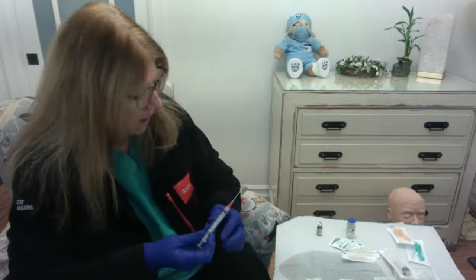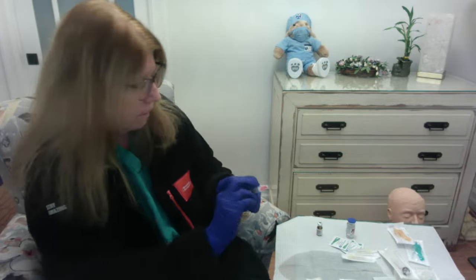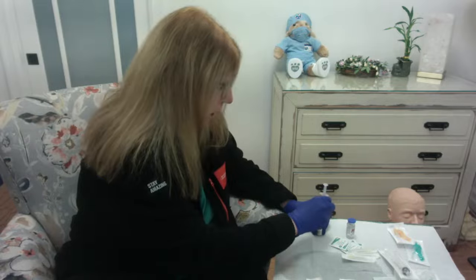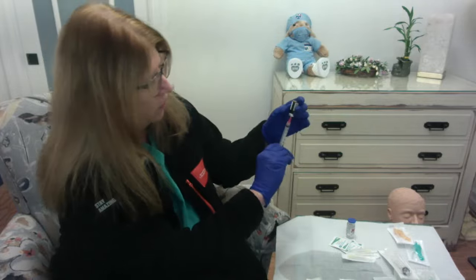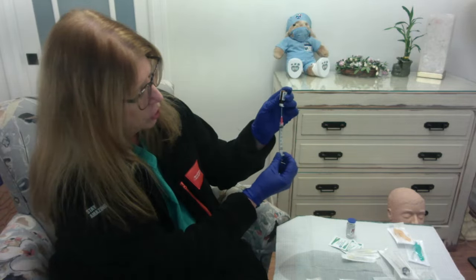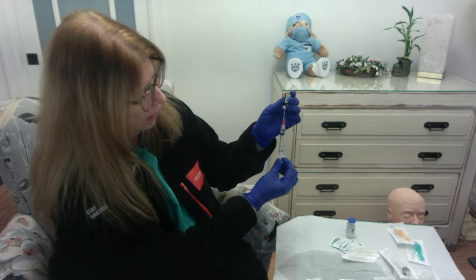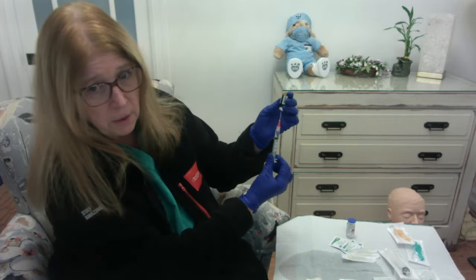So just to show you on the table what this would look like: I would have my vial on the table. I'd pull back my 1 milliliter of air. I hold the vial steady between two hands, put the needle in, put my air in, invert, make sure that the window is facing me, and then having the calibrations also facing me, I'm going to start pulling back on that plunger to get to my 1 milliliter mark.